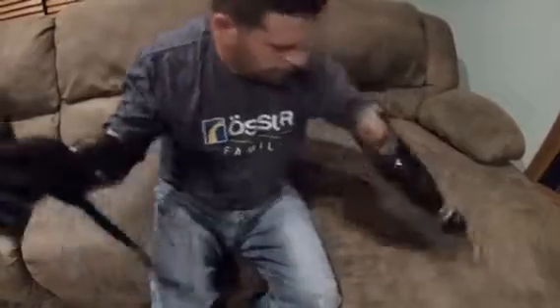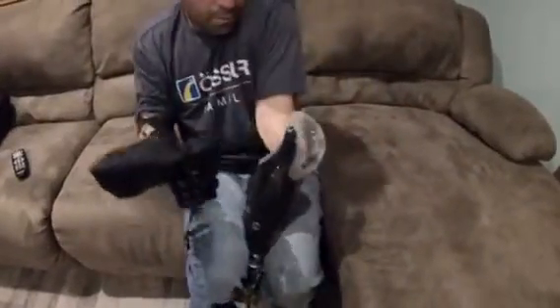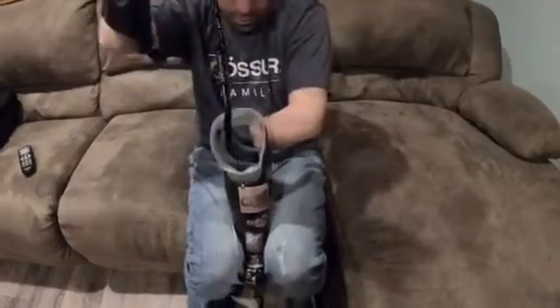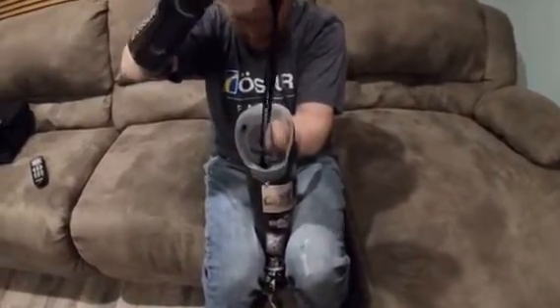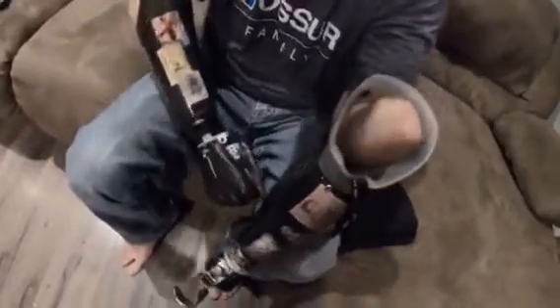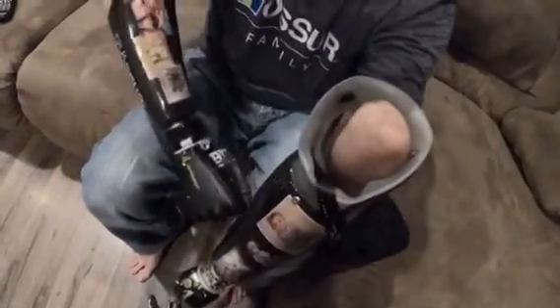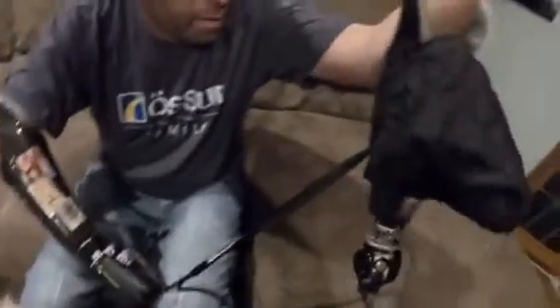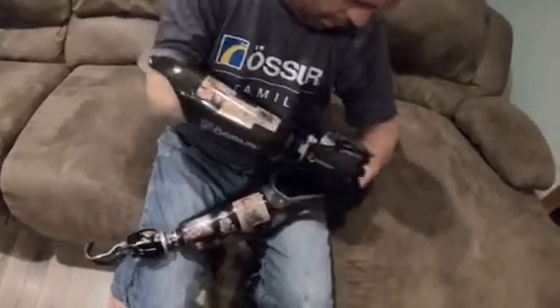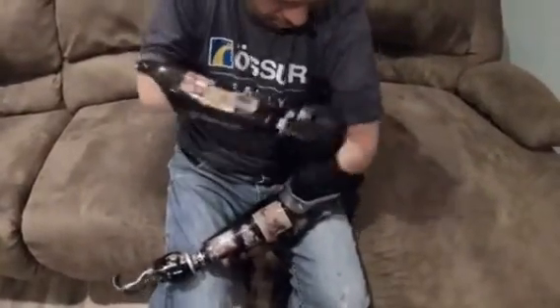I grab the same bag on this arm — I wear an ETD. On these on/off switches, it helps that the on/off switch is in the right location. That's a big key — if it was on the bottom side, I might not be able to open it or turn it on and off as easily.